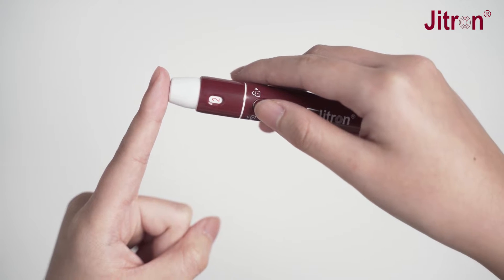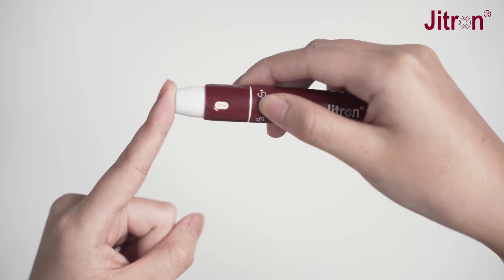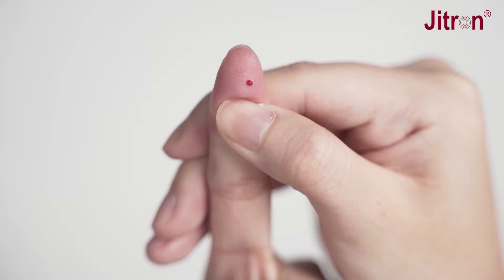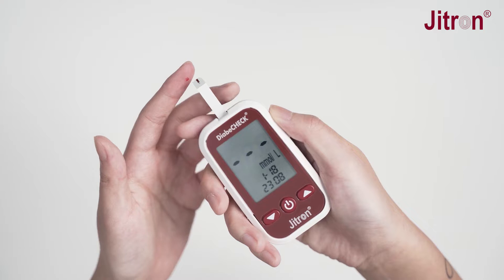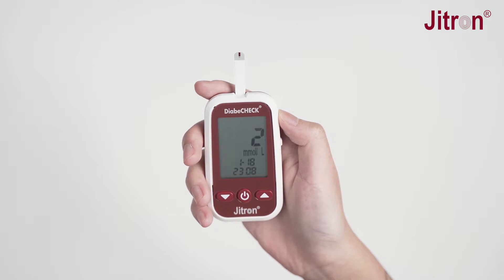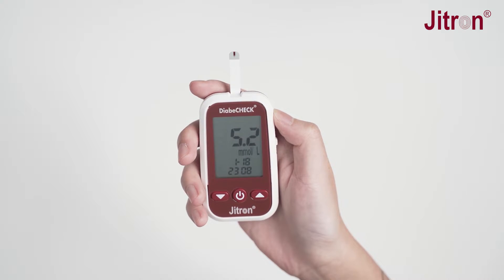Place the lancing device against the soft side of the fingertip and press the release button. Gently bring the test strip and touch the drop of blood at the edge of the strip. The screen will start to count down.